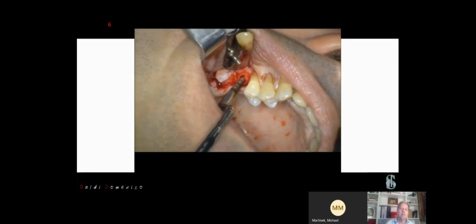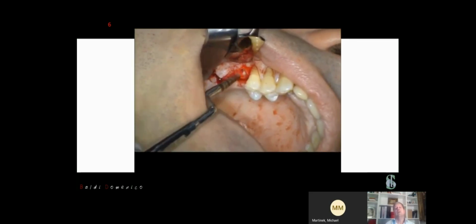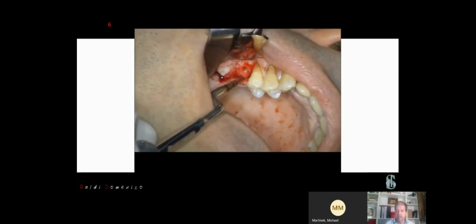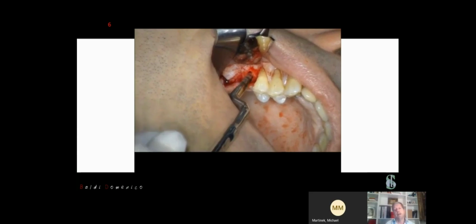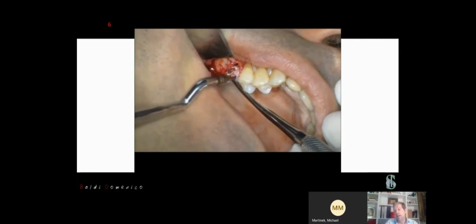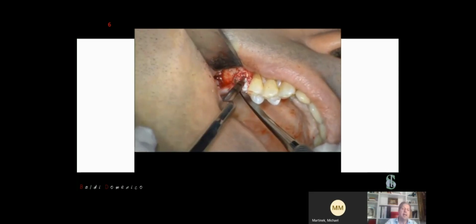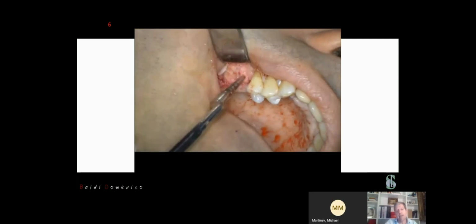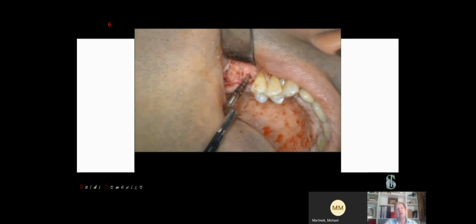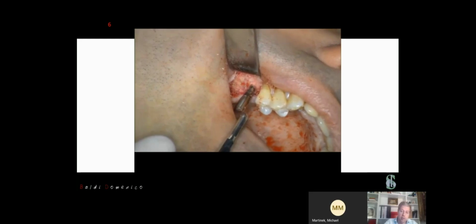So I prefer to first of all gently lift the membrane with the low power magnetic mallet, side to side, in order to make the elevation. And of course, with this collagen we can place the filler, and again with the mallet at low power, we can push the filler inside our sinus. And using this instrument, you can see how it is possible to control and manage this kind of surgery in a really gentle way.